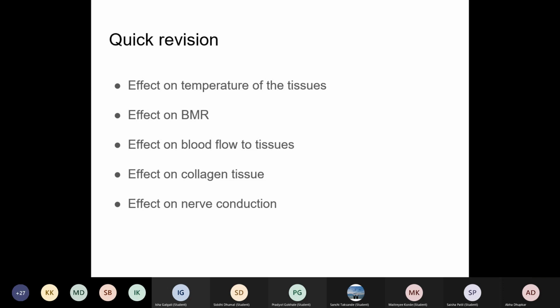If the cell metabolism has increased and the functioning of the cell has increased, it will have an increased capacity to promote healing in that region. So your healing capacity has increased. Then when you are looking at the tissues by themselves, the collagen extensibility is going to increase.